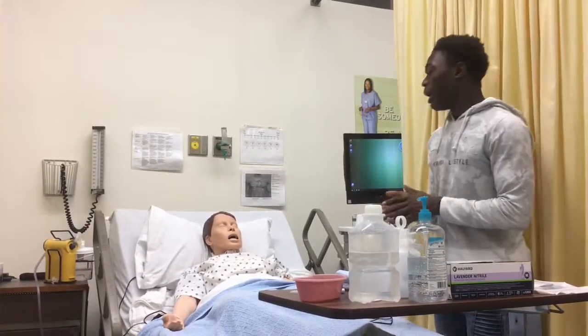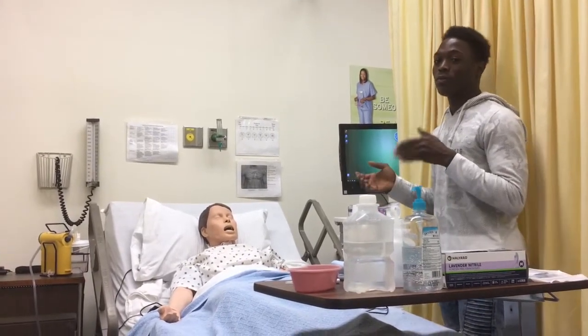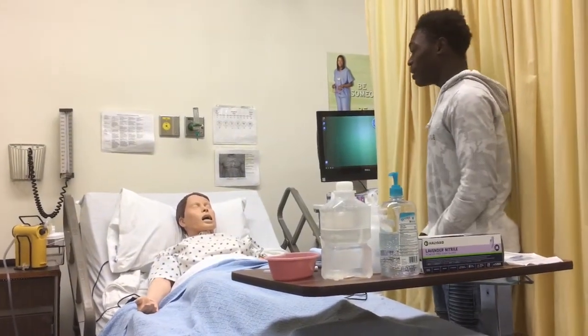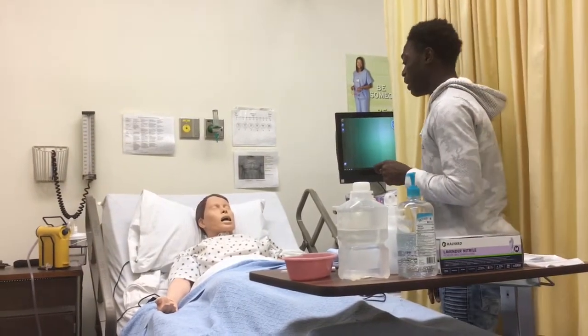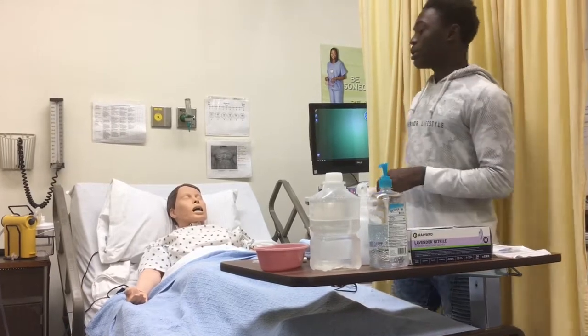Okay, good. And you want to tell the patient what you're going to be doing, because you always want to inform the patient of any procedures that the doctor has ordered. Like, okay, so I'm going to be inserting an NG tube in you today because the doctor has ordered it. Is that okay with you? Okay, great.